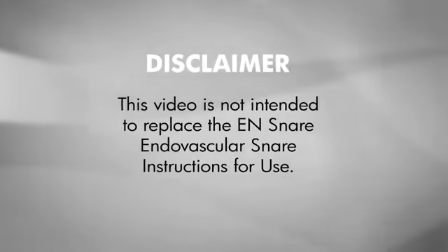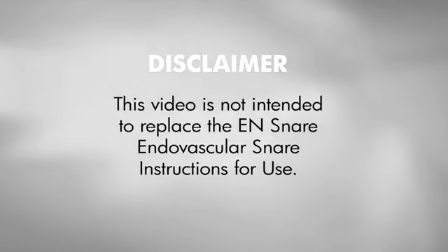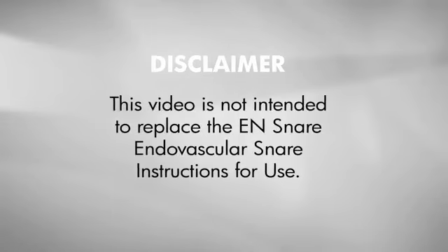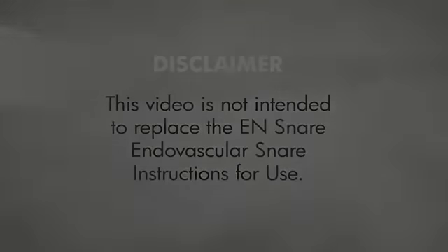The following procedures are examples of clinical situations in which the Snare could be used and are not intended to replace the Snare instructions for use. Additionally, procedural protocols will vary among clinical institutions.